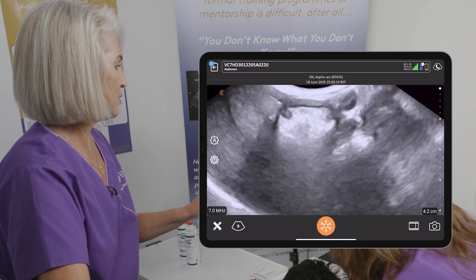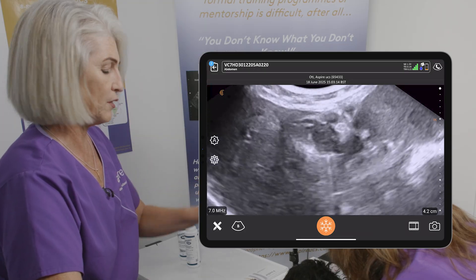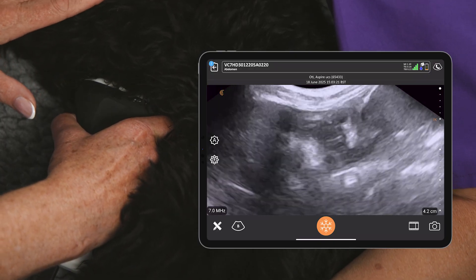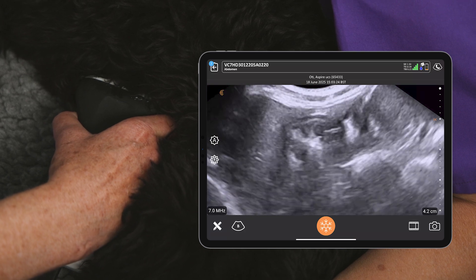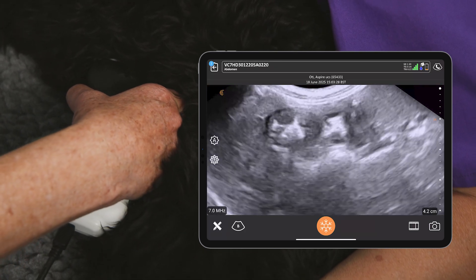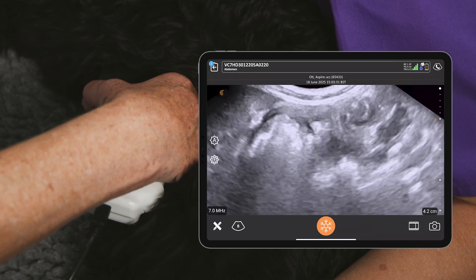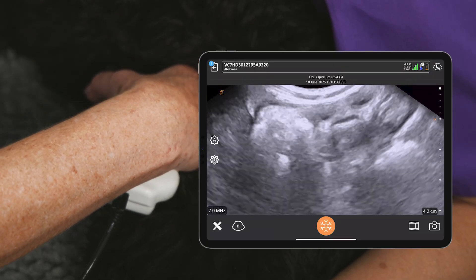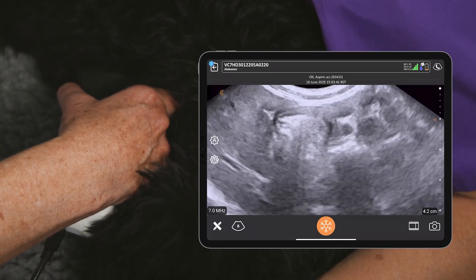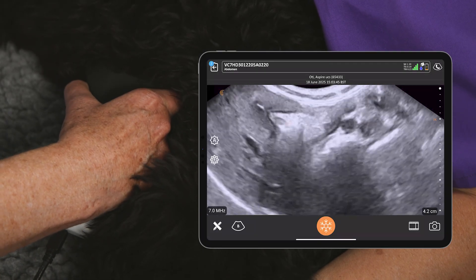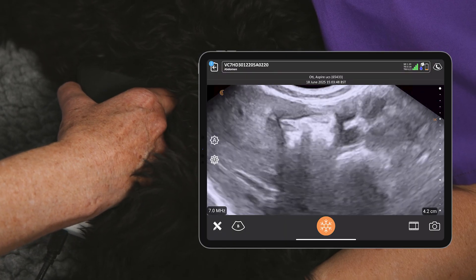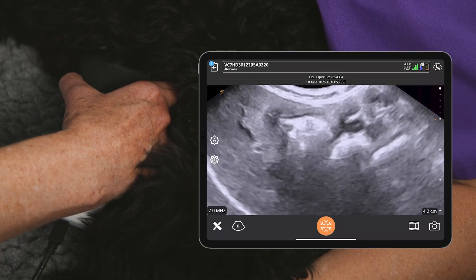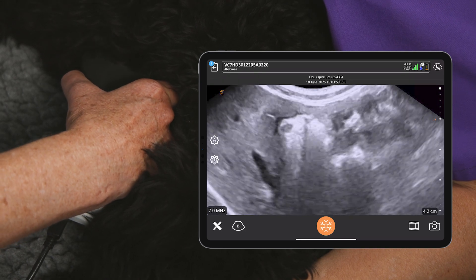Back to dynamic mode — here we've got little rugal folds as I'm scanning all the way through, fanning upwards towards her rib cage until I run out of stomach, then going back down to the horizontal aspect with the stomach in the middle. Scanning down towards the table top takes me into the outflow tract and the pylorus. If you were looking for a foreign body, this is the area to look. Don't over-call it though — you can see little bits of ingesta casting small shadows; you want something with a nice sharp acoustic shadow if you're considering an attenuating foreign body.